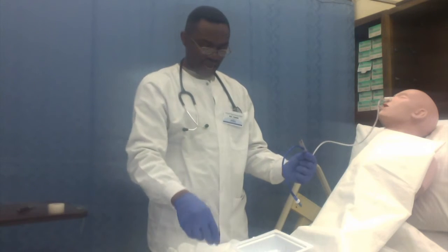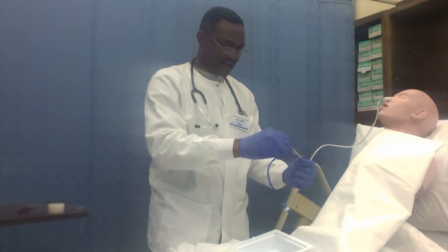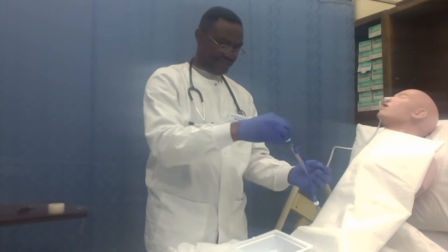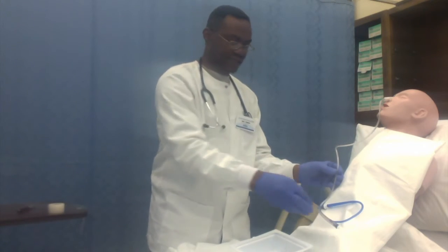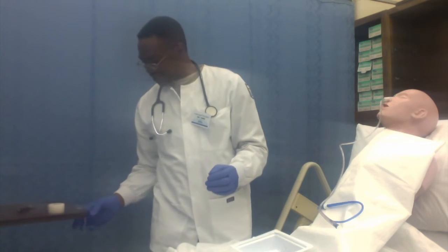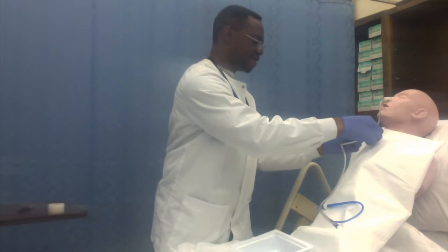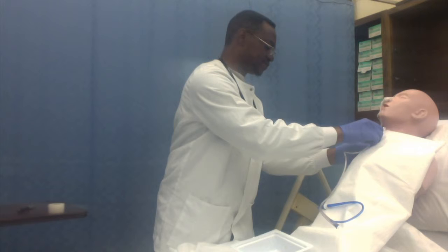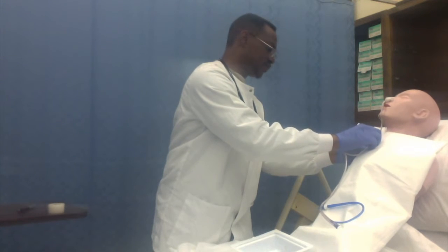If not, I will just clamp the tube and leave it in place for future use. I will now proceed to secure the tubing on the patient, on his gown.